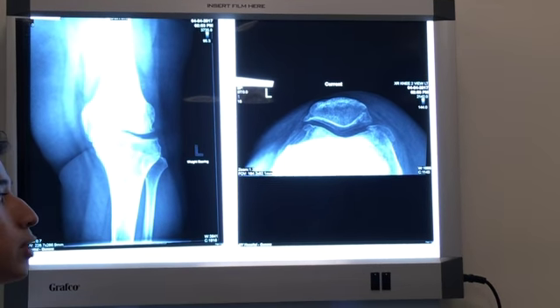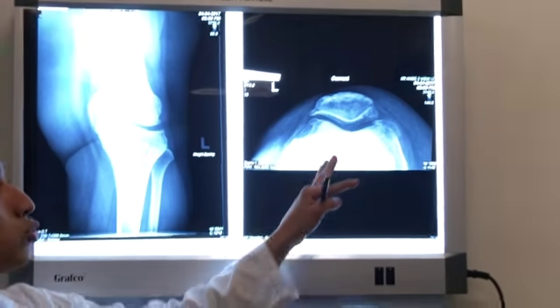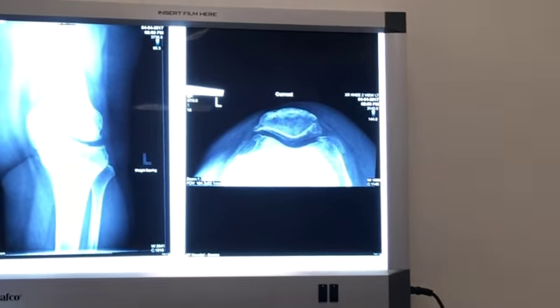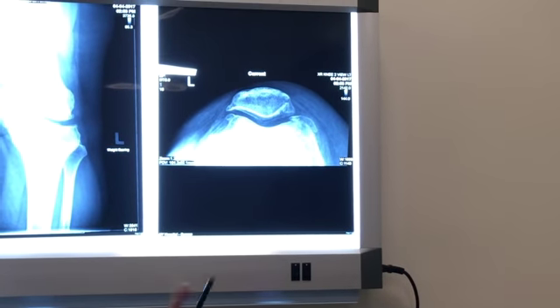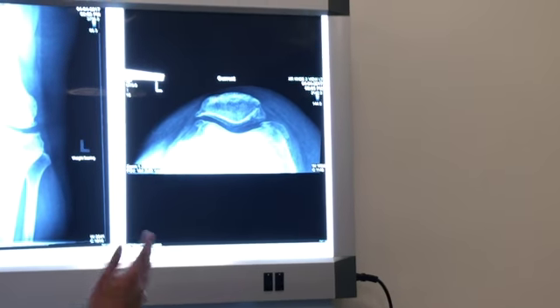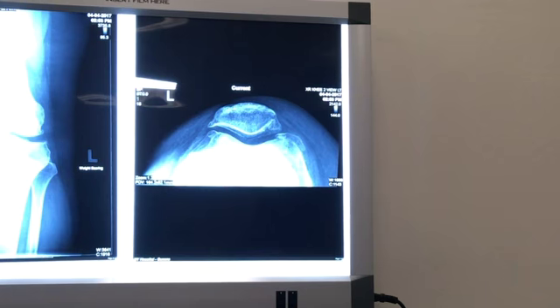Then one of the technologists told me that in order to help with this, I should ask her to bend both knees, and I did so, and it did help. However, she could only hold this position for a really short amount of time. So when I put her in this position, I had to run back and take the exposure, and thankfully we were able to get the radiographs.